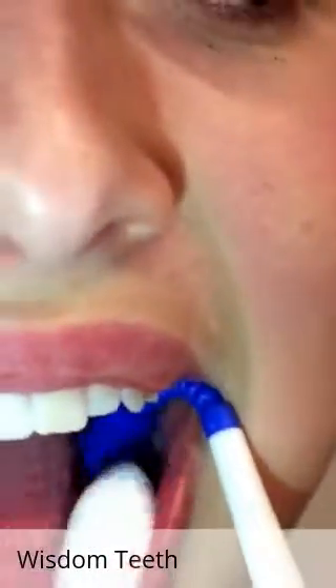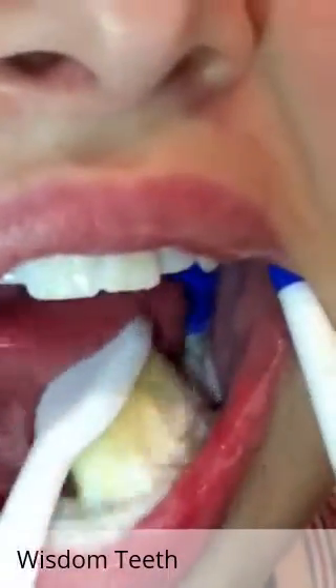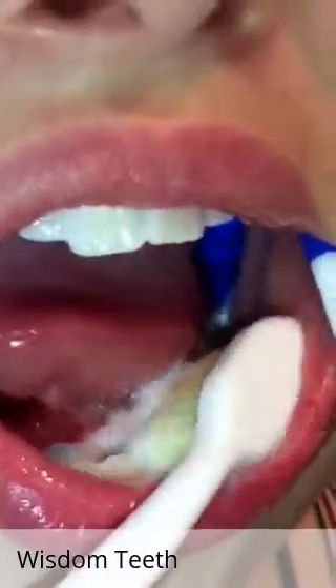She covers the surgical site, as you can see, and she can get right in there brushing that area right up against that second molar — exactly where we want her to be.